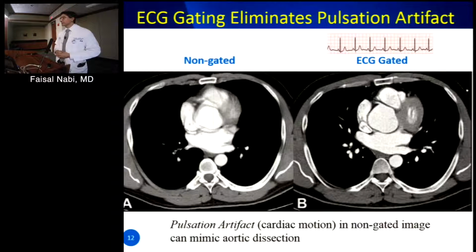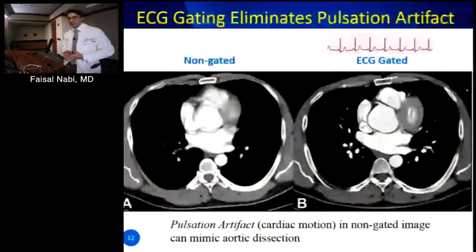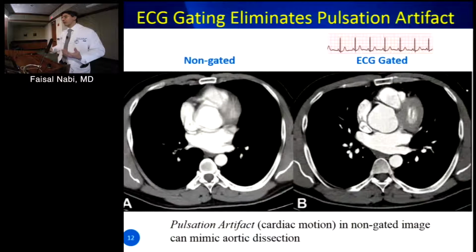Now, most CT by radiology is not gated. From my experience, one, they're very uncomfortable with the EKG rhythms, and number two, they feel that it increases radiation dose, and that they're very comfortable reading around these artifacts. They recognize them. But when it comes to serially following measurements, you really have to. And there have no doubt been cases where people have been referred to this institution with dissection, and the study's ungated. You repeat a CMR, and there's nothing there.